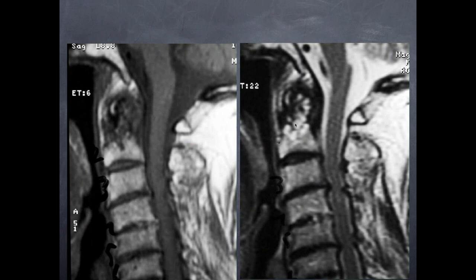Two sagittal images again showing lots of abnormal signal along the dens.